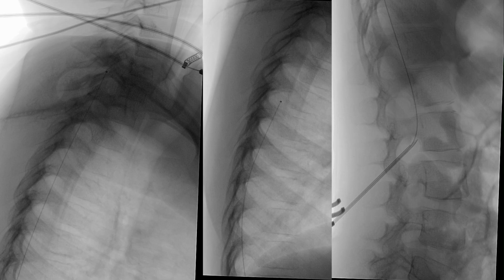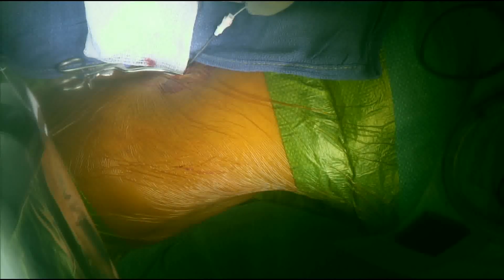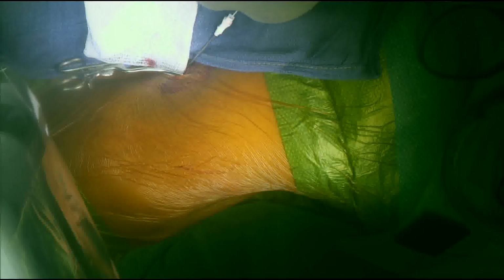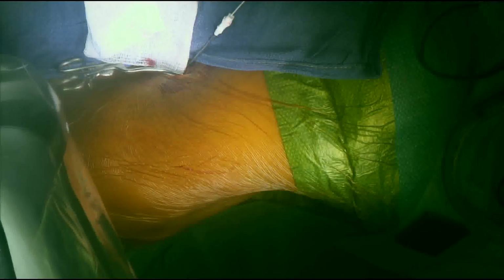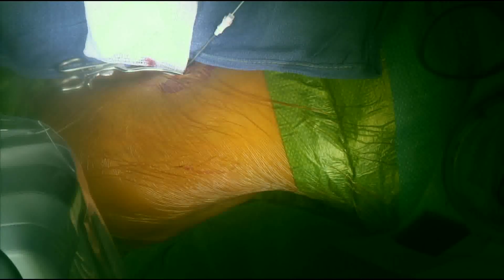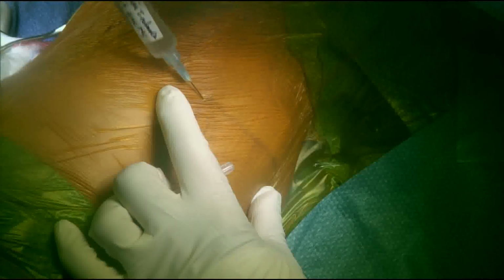In case the tip location needs to be adjusted, feel free to push it in further or pull it out, depending on what you see in your fluoroscopic images. Once you have reached this stage in the procedure, if you have another surgeon, he can start preparing the abdominal pocket, as you no longer need to use the image intensifier.